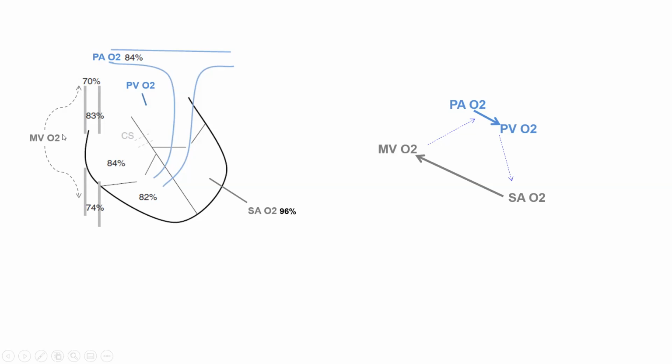And by the way, maybe one note before that, how to calculate the mixed venous O2 saturation. If you want to, you can just use the SVC before the step up. You can use this as the mixed venous O2 saturation, 70%. If you want to use the IVC in the equation, it's fine, but be careful, use 3 of this plus 1 of the IVC.